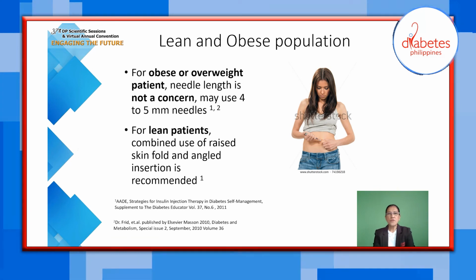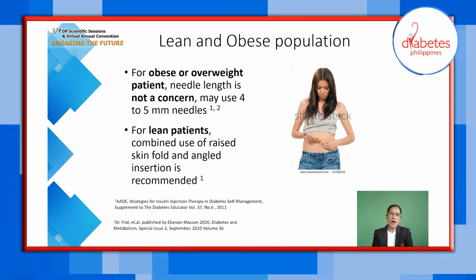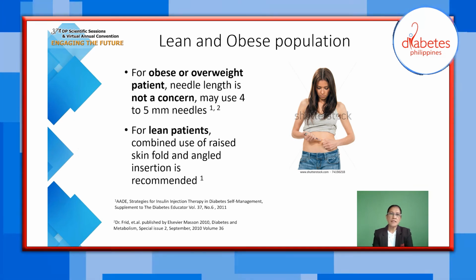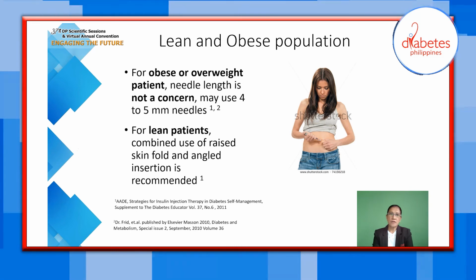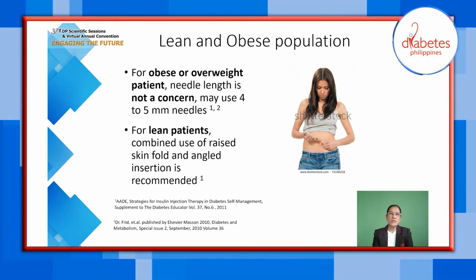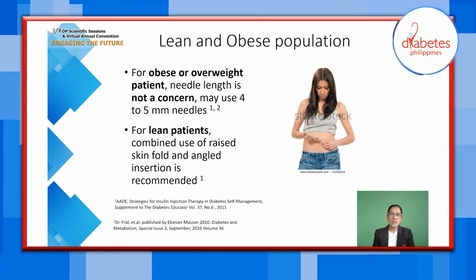Now for the lean and obese, it is also recommended that they can use 4 to 5 millimeter needles. For the lean patient, o yung sobrang payat, skin fold is necessary to ensure that the insulin will hit the subcutaneous tissue.